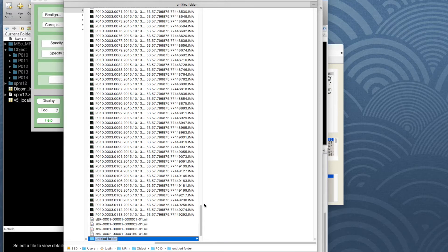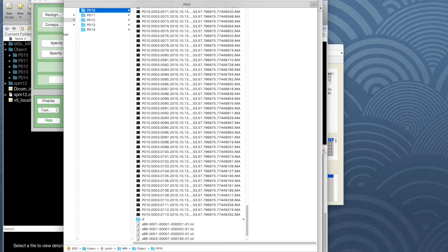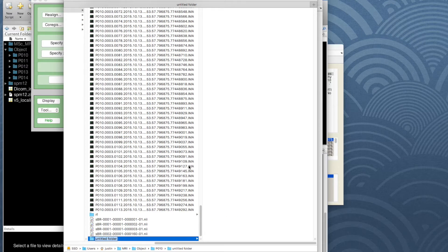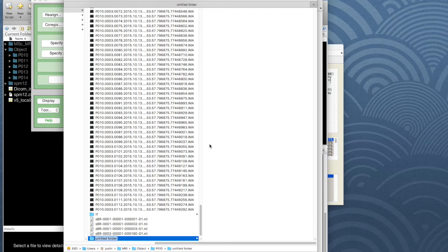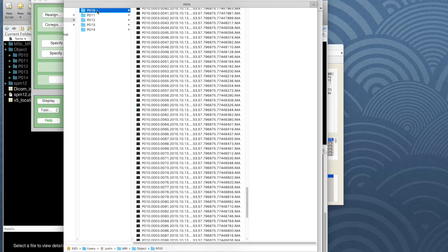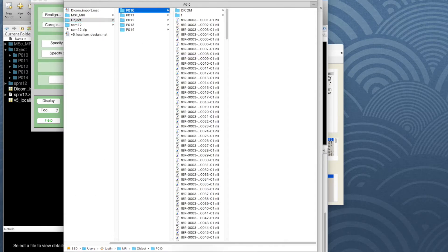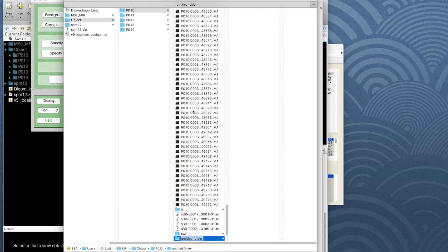We are going to realign the functionals, so we'll have a realigned functional folder called RF. Then we're also going to warp or normalize those images to match the template shape so we can do direct statistical comparisons — those will be the warped realigned functionals, so I'll make a folder for those. After warping, before we do the statistics, we'll smooth them, giving us smoothed warped realigned functionals — I'll make a folder with that name. We also have structural images and we're going to do lots of things with them, including segmenting into grey and white matter and creating a 3D surface render, so we need a separate place for all that.